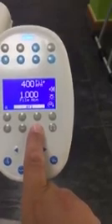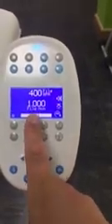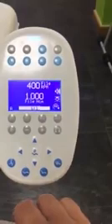So when you're setting up for endo mode, the first thing you want to do is actually tell it what type of handpiece you're using. So in this situation it is an 8:1 handpiece. I can use this plus and minus here to adjust that. So let's stick there with a 6:1 handpiece. Really important that we do this bit first, because this means we'll get an accurate reading for the torque and the speed settings above.